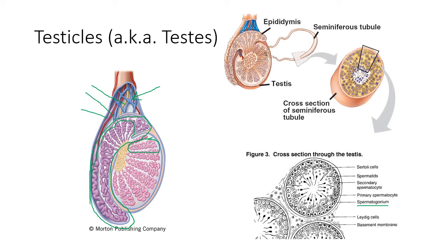The other accomplishment of meiosis, besides halving the chromosome number and giving you 4 gametes, is that it also allows, through that crossover step, for the mixing up of the combinations of genes present on individual chromosomes, so that those 4 gametes are going to be all genetically different from each other in terms of which gene combinations they have. So the spermatogonium starts out around the periphery of the seminiferous tubule, and then as these spermatocytes, as we then call them, start to undergo meiosis, they migrate towards the center of the tubule. So as they are doing this process, they gradually move toward the center.